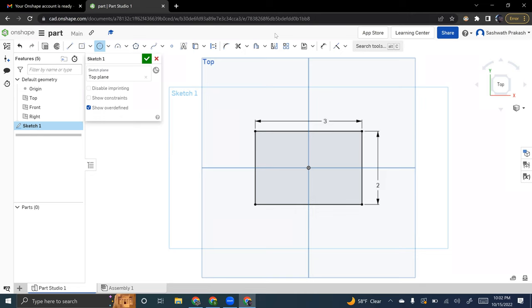Thank you. Okay, so the dimension tool is this kind of diagonal looking arrow thing. Good, and then you don't click on the point, you want to click on the edge, right? So then you're gonna click that, and go a little left so you can see the number a little better. You can just left click once, and then you're able to change the number. Make it 3 for the top. So 2 for this side, and 3 for the top.